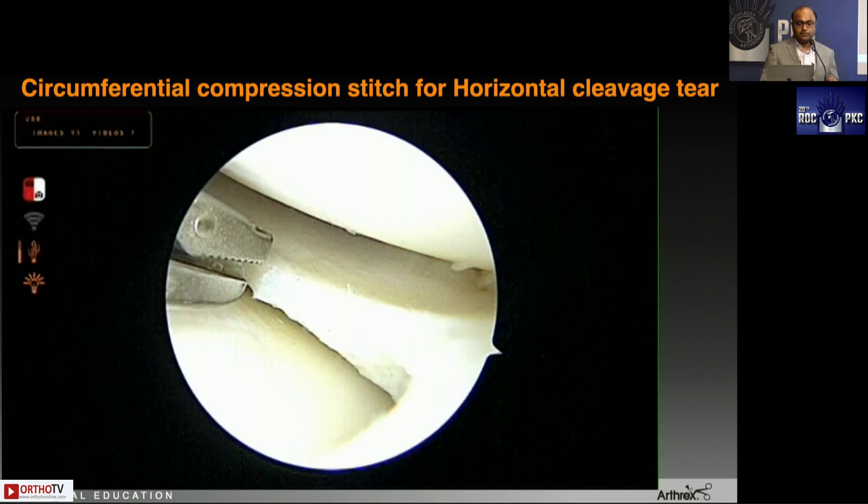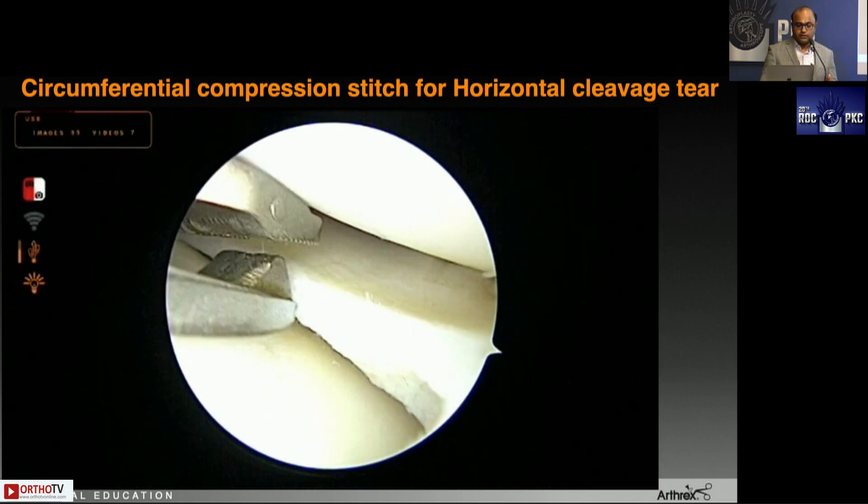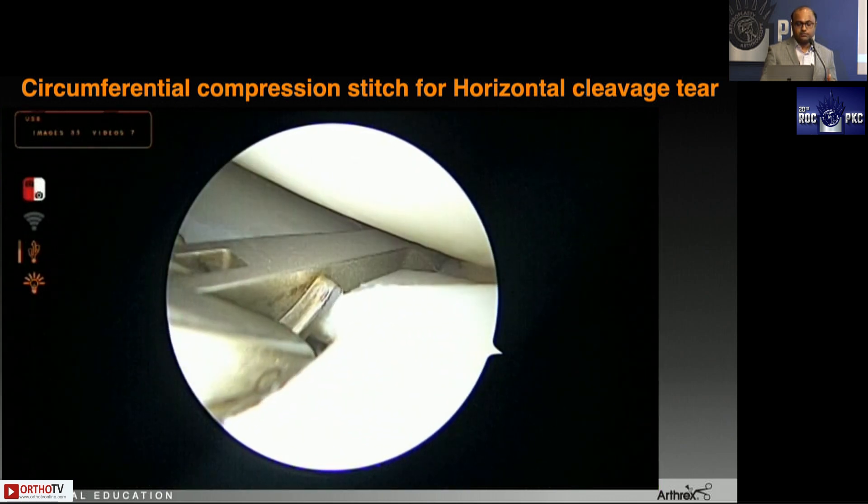The second most important indication for the knee scorpion is when you are treating a horizontal cleavage tear. In the past we used to do a partial meniscectomy — remove the unstable flap and keep the stable flap — but lately we've realized these tears come in younger individuals and you can lose most of the meniscus. The first rule is always repair: even if there is a portion you want to resect, first repair and then resect, because when you put your shaver you might suddenly have no more meniscus to repair.